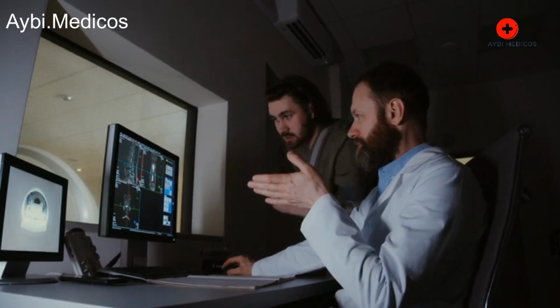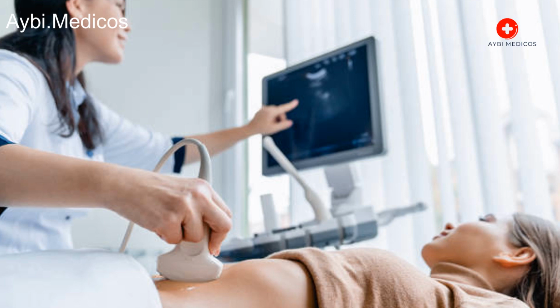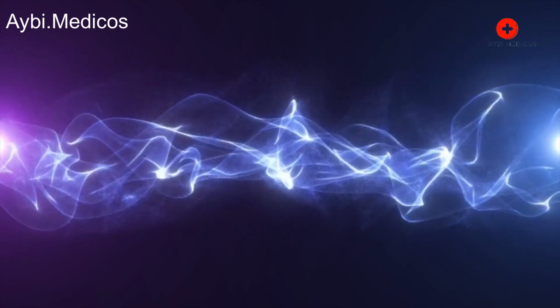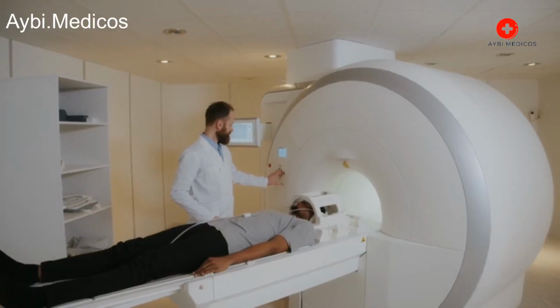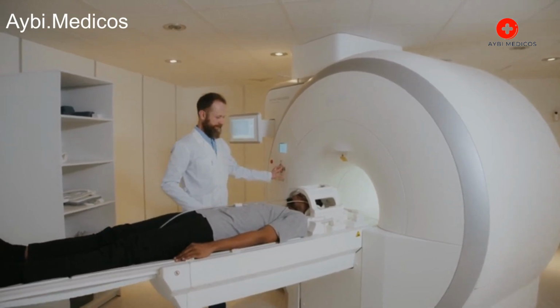How ultrasound works. Transducer. The primary tool used in ultrasound is a transducer, which is a handheld device that emits and receives sound waves. The transducer contains piezoelectric crystals that convert electrical signals into sound waves and vice versa. Sound waves. The transducer emits high-frequency sound waves, ultrasound waves, into the body. These waves have frequencies above the range of human hearing, typically between 2 to 18 MHz.